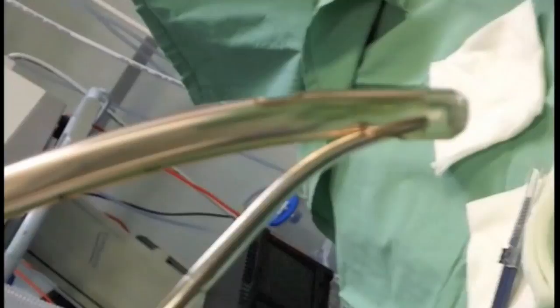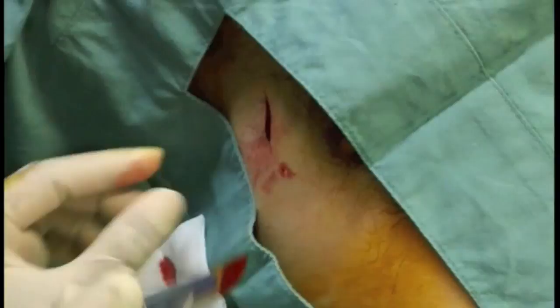Throw away the trocar and insert your big curved forceps through the end of the tube — a 32 French is big enough. Cut through the skin to fat, approximately 2.5 cm, then dissect down to the intercostal muscle.